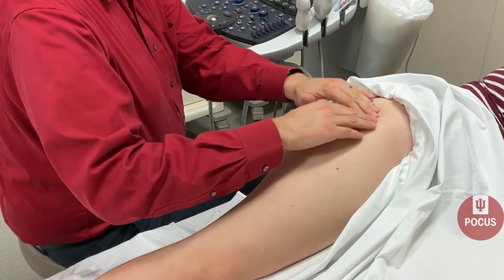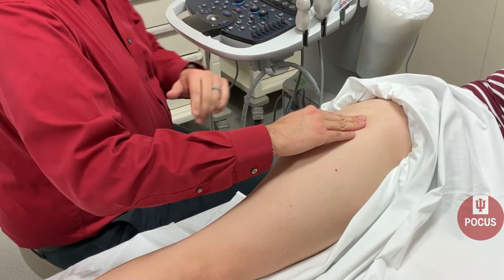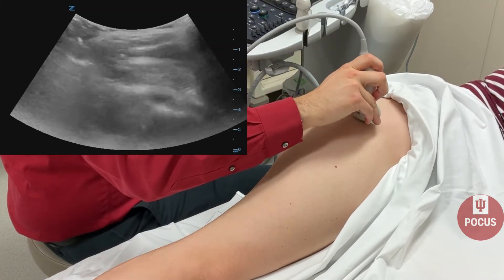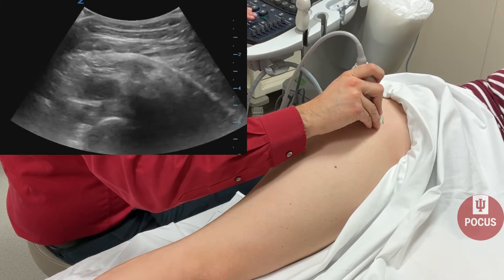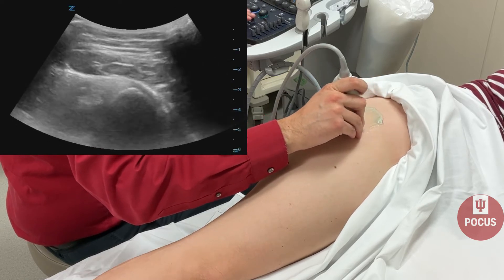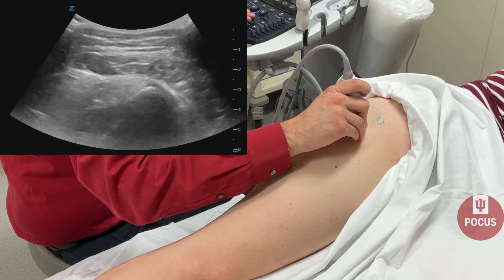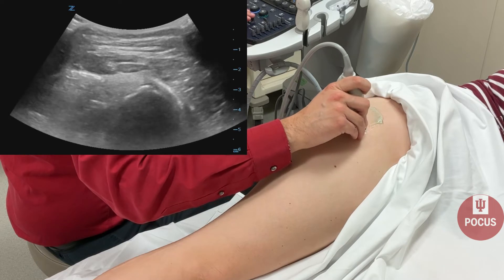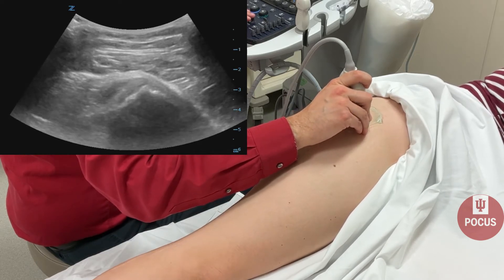Next, we'll palpate the lateral hip and find the greater trochanter. We place our probe right on the greater trochanter in the transverse plane. What we're looking for is a rooftop appearance. The greater trochanter is where bursitis might occur, though it's actually very uncommon to find bursitis — more often, we'll see pathology with the tendons themselves.